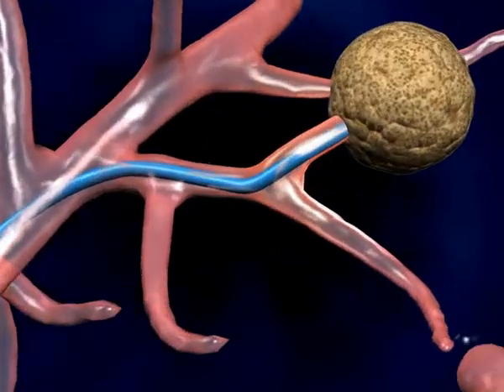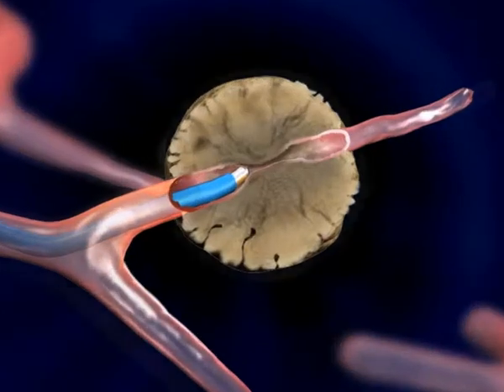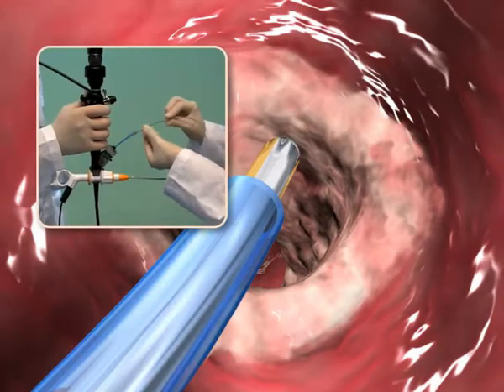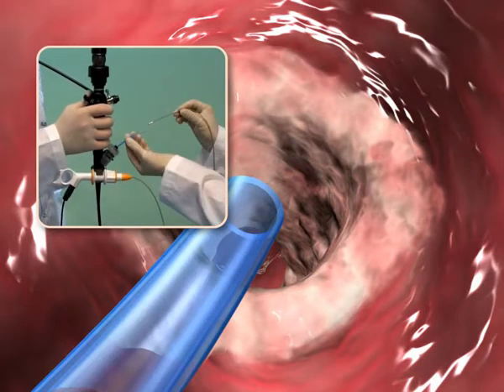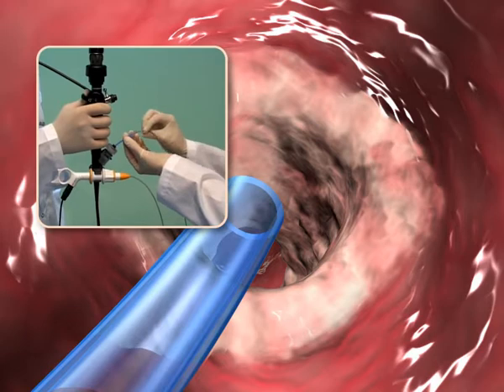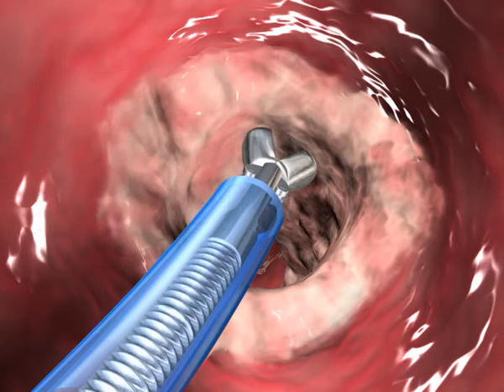After reaching the target, the guide catheter is locked in place and the steerable navigation catheter is removed. The guide catheter now serves as an extension of the bronchoscope channel, providing the physician a pathway leading all the way to the target.